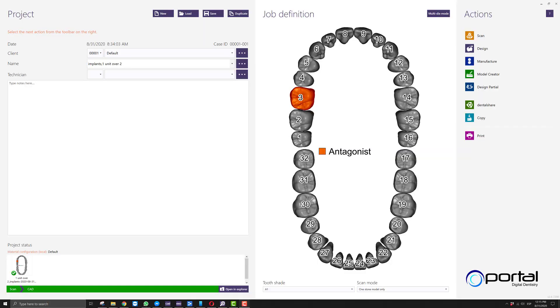Hello everyone! I created a new video today to answer a question I've seen often in the Facebook forums, and that is how to create a single unit that is supported by two implants.